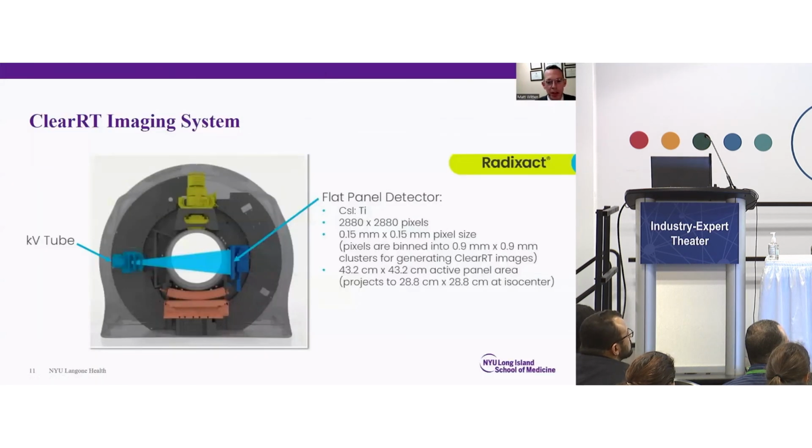So we do this on all of our patients who are treated on our 3 CyberKnife units. 100% of these patients, we utilize this track, detect, correct ability, this synchrony ability on the machine. And we also are excited to use it on the Radixact as well.